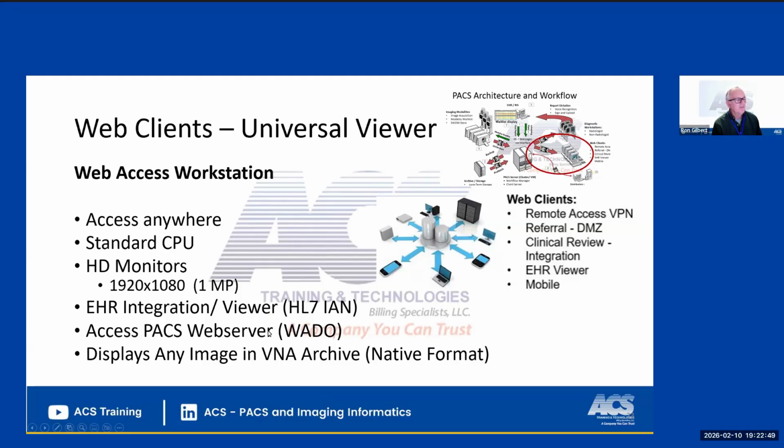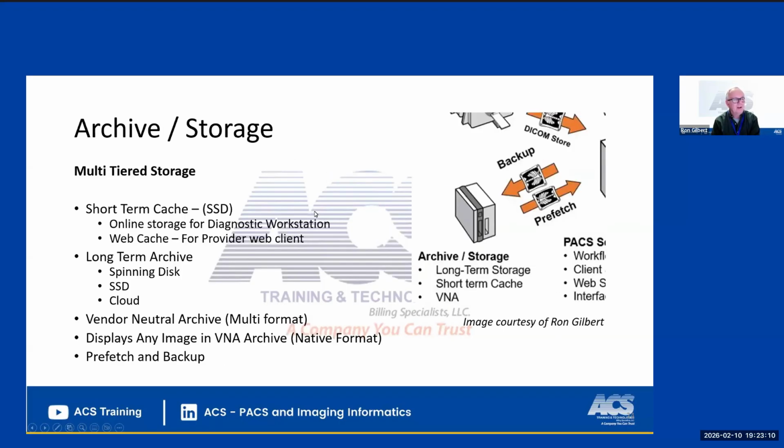You're going to learn what software and how the images get displayed. So if the images break, you'll know how to fix what makes them work. And then also you'll look at the archive and how you store things and how you retrieve things. So that's very basic, but there's a lot of users out there, and you have to figure out how to keep them happy. But you know what? Once you get the system running right, that's all you really need to think about.